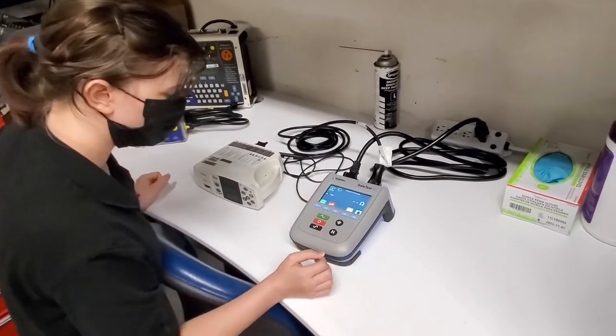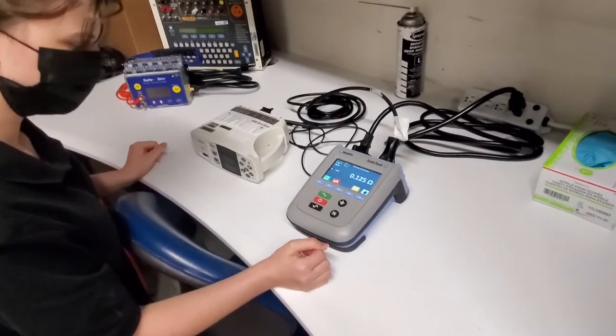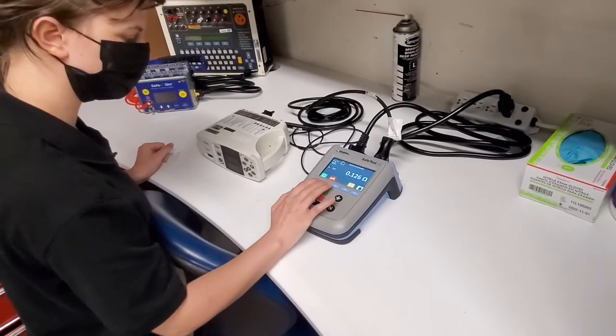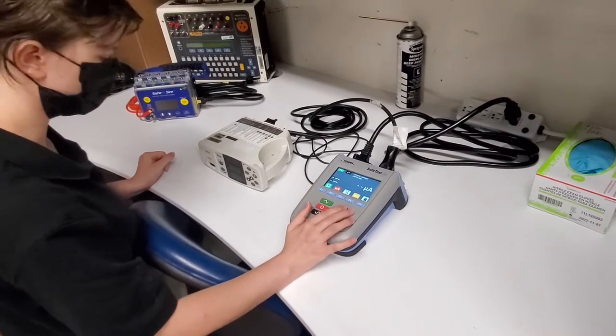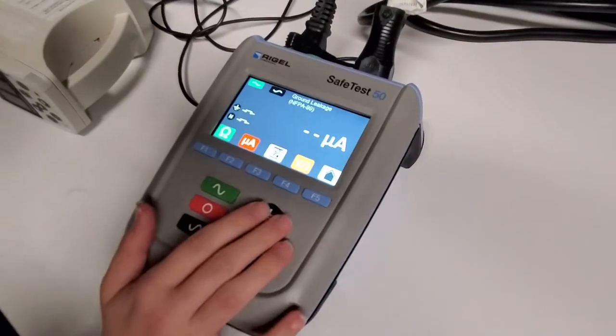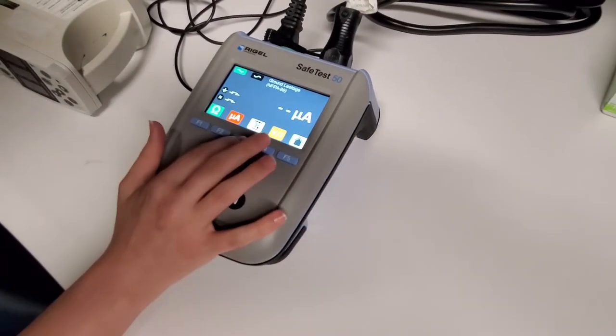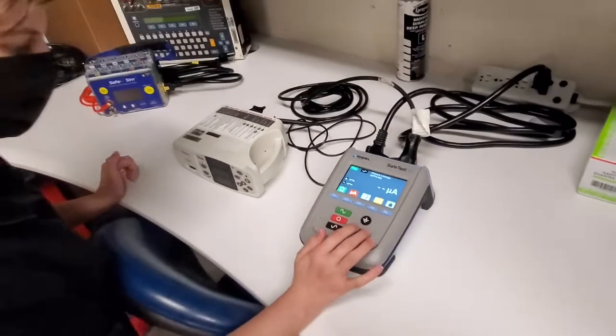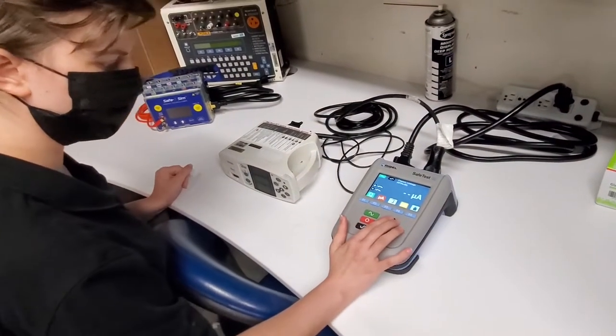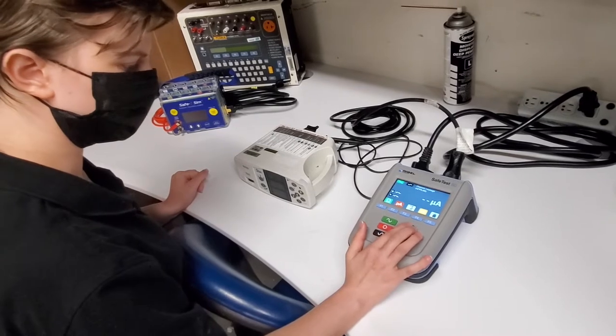So our first test we're going to do ground resistance. No problem. And let's see what setting are we on. We're on ground leakage, let's change the leakage. There you go. Chassis. And we're connected. So go ahead and green for go.